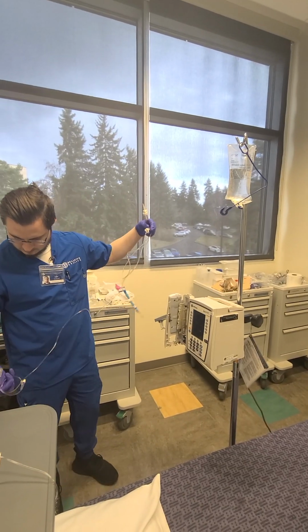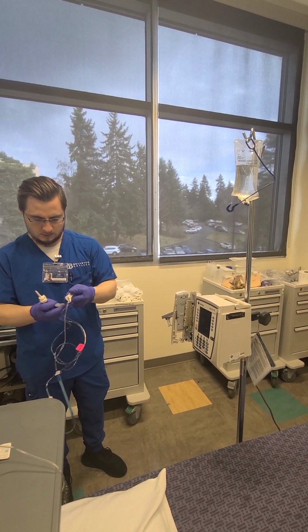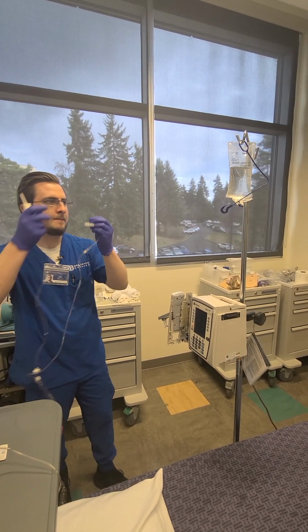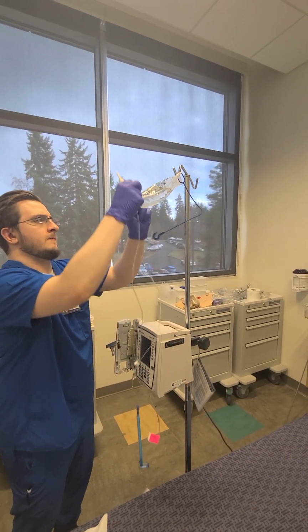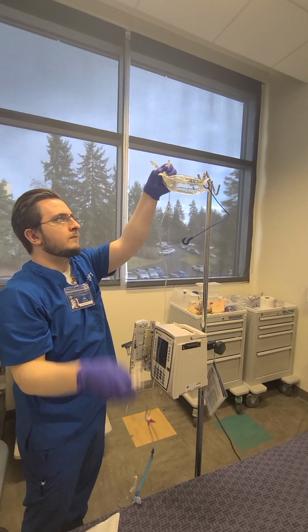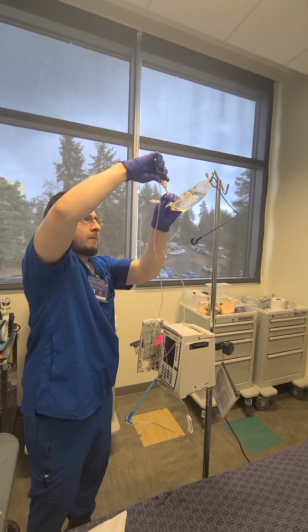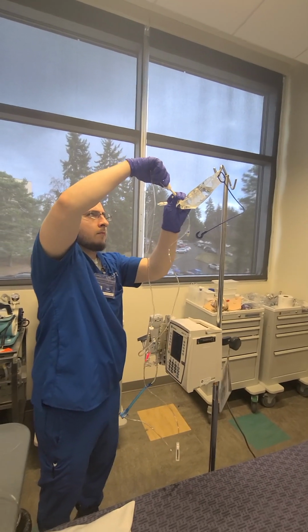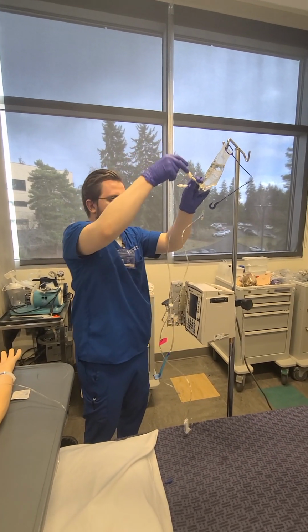Draw out 2 milliliters of air. And I've got my blunt needle. Careful not to touch it. Connect my syringe. Keep the cap off. I'm gonna push the air in first, and then draw out our medication.